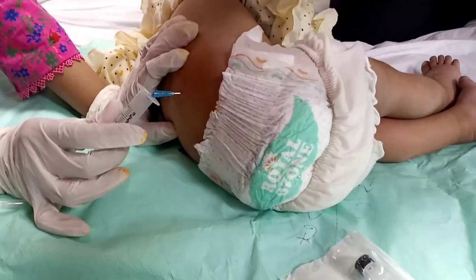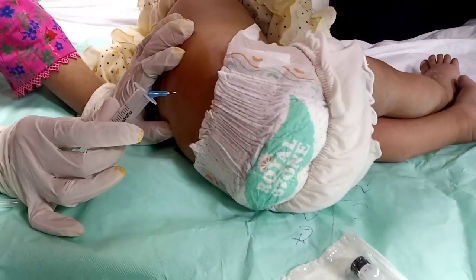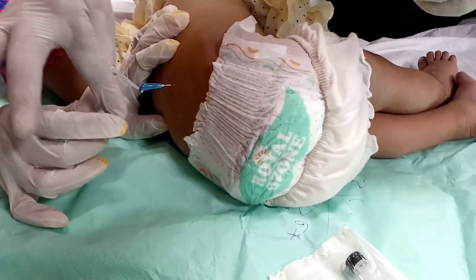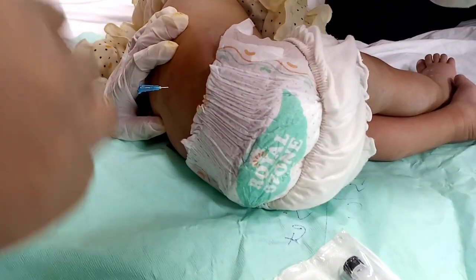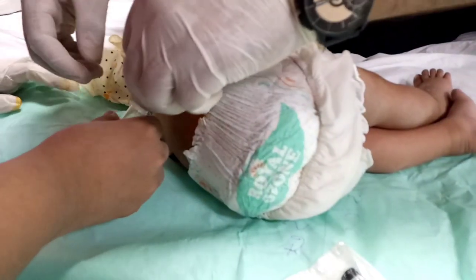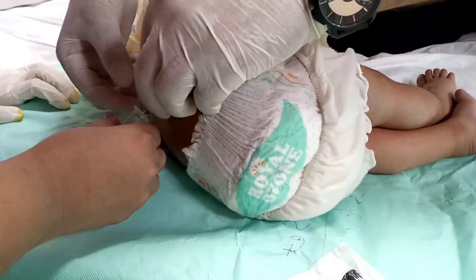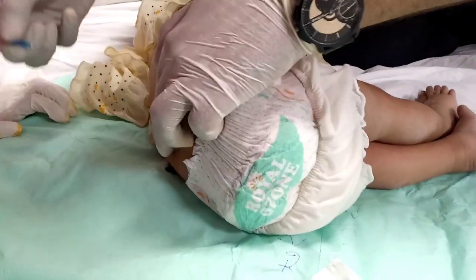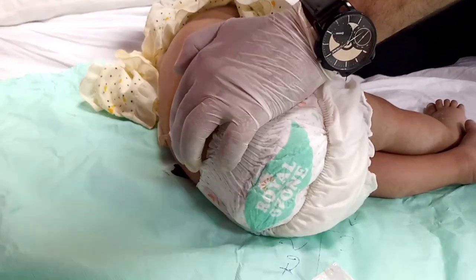Risks and complications include headache, back pain, infection, bleeding, and nerve damage. Post-procedure care includes rest.